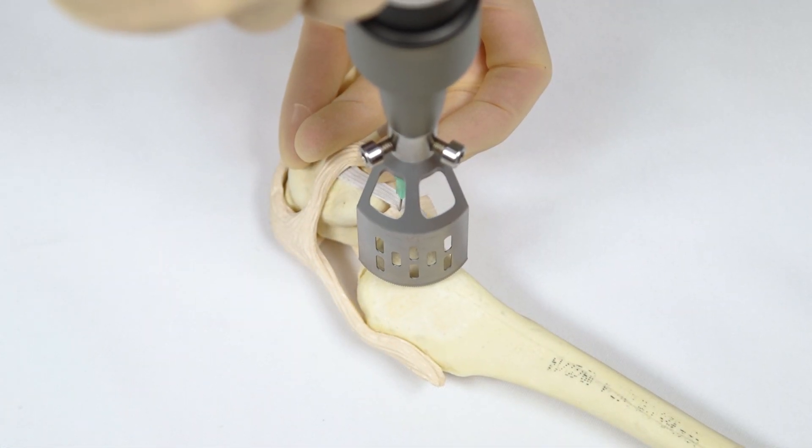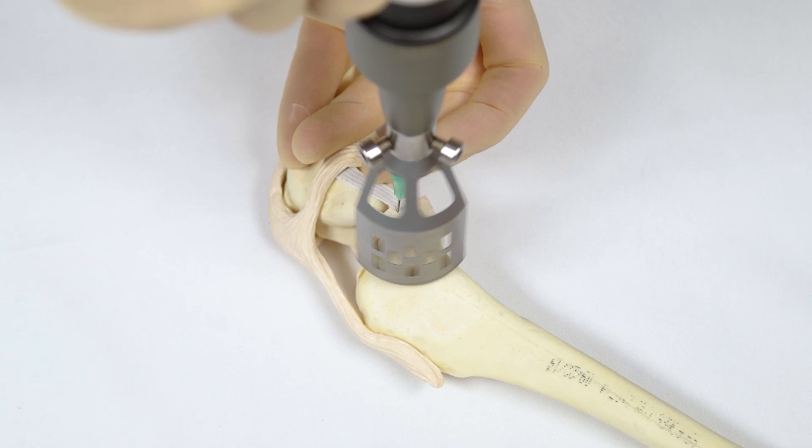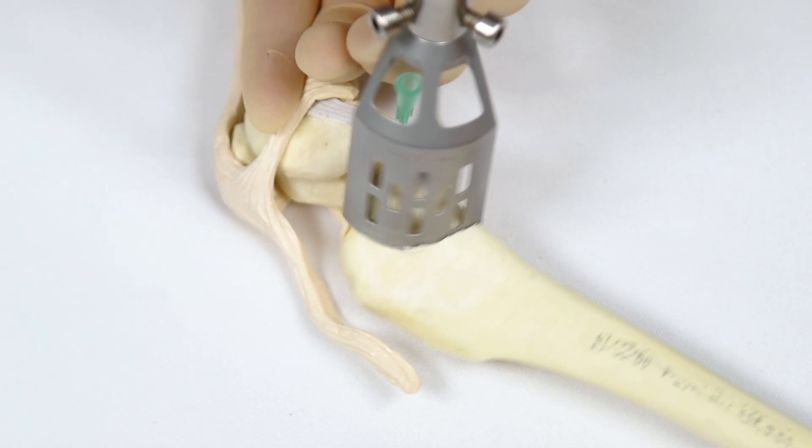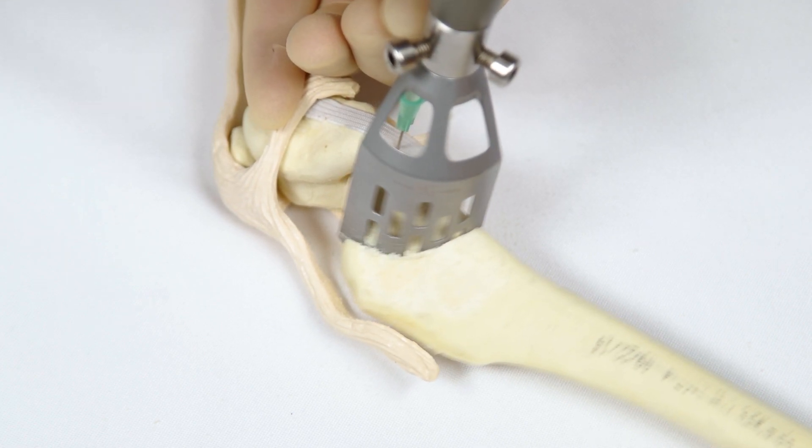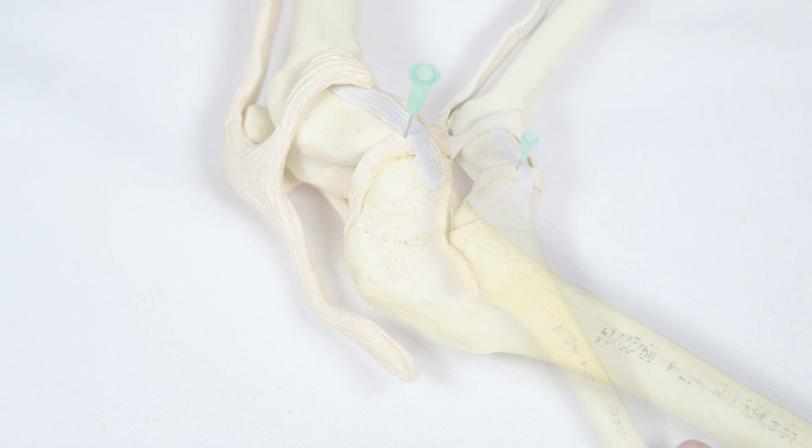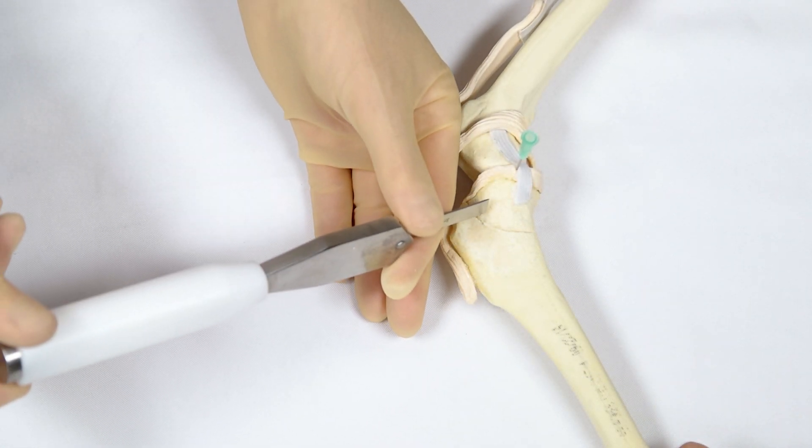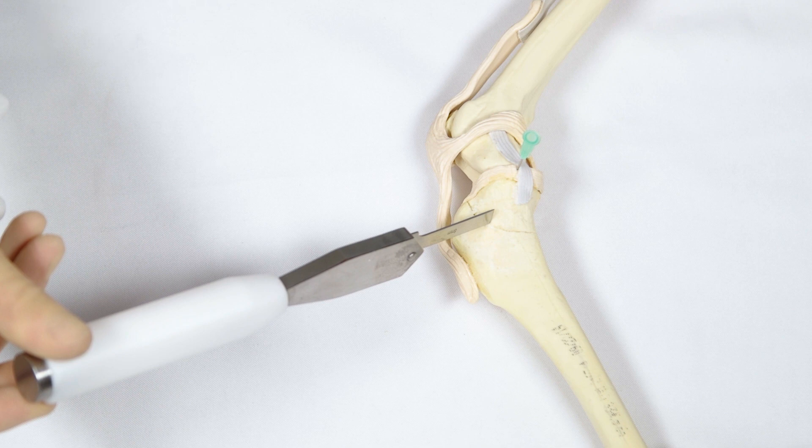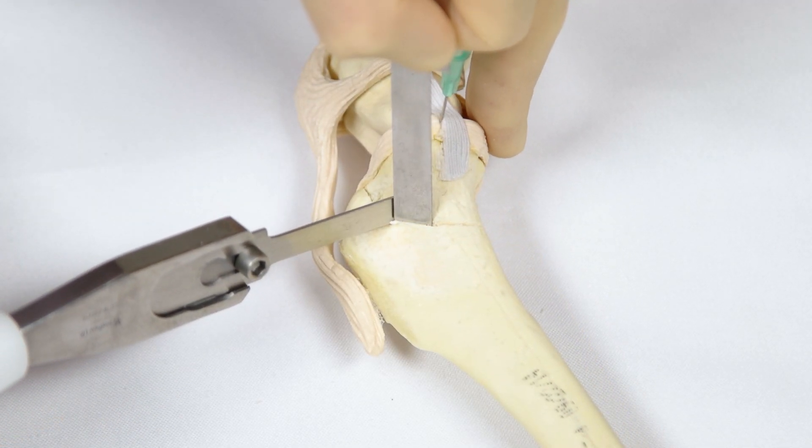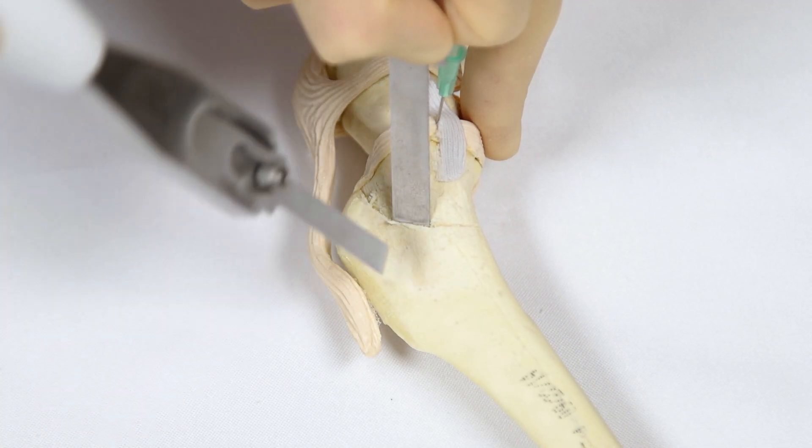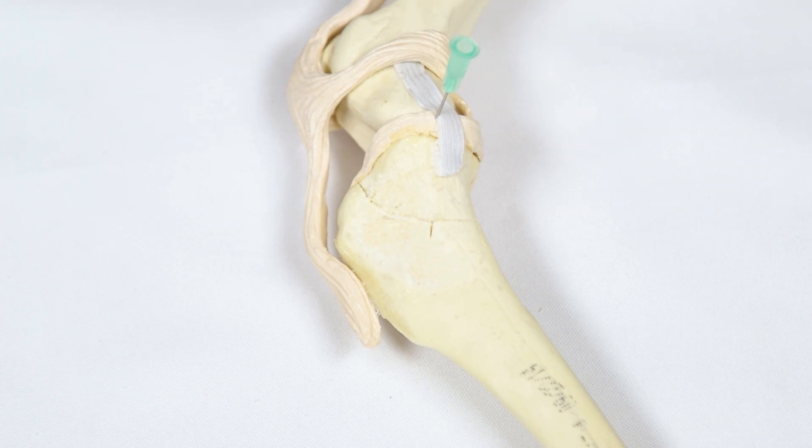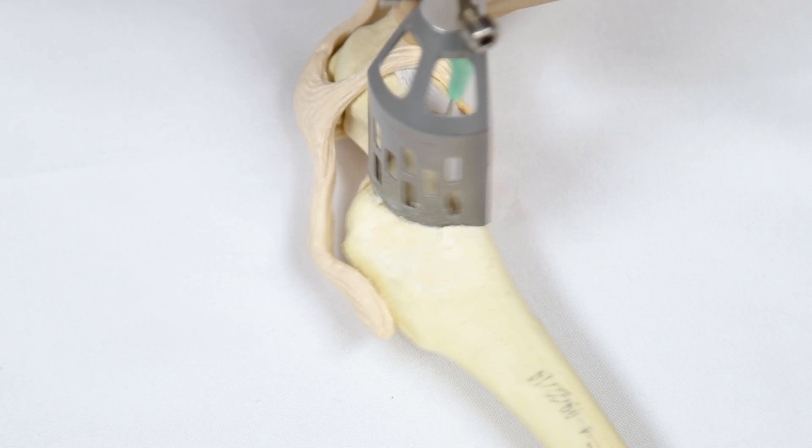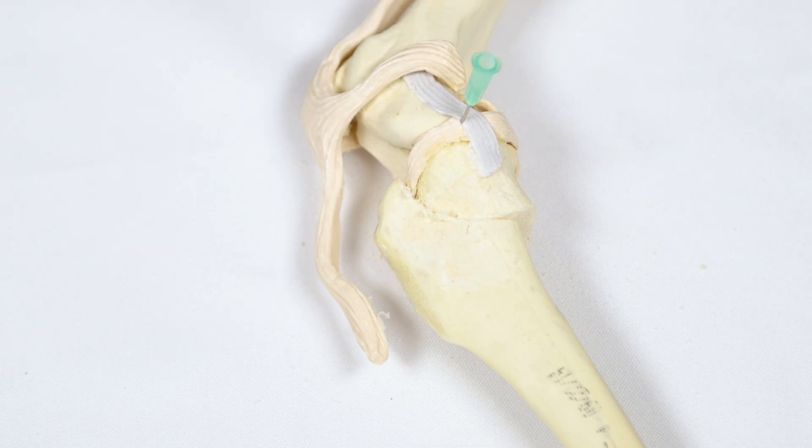Holding the TPLO saw perpendicular to the tibia, the osteotomy is started by hovering the saw at full power over the bone and then gently bringing it down to make contact. Once a partial or half depth osteotomy is created, the rotation distance is marked on the tibia. Using a small osteotome and mallet, create two marks that are separated by the same distance as the rotation measurement that was calculated during preoperative planning. Once the rotation marks are made, the osteotomy is completed to full thickness.